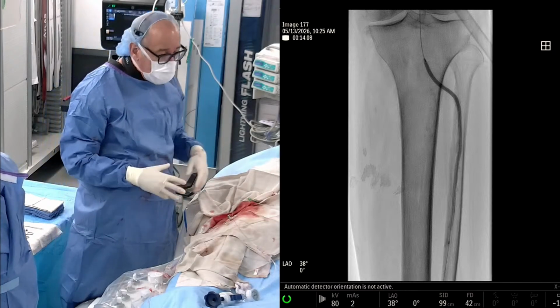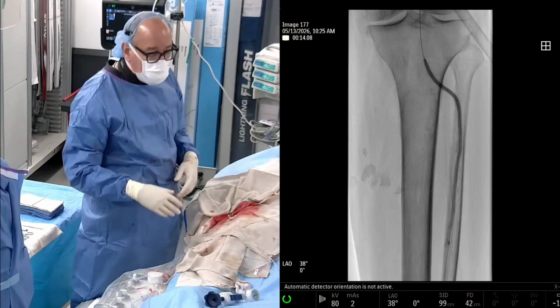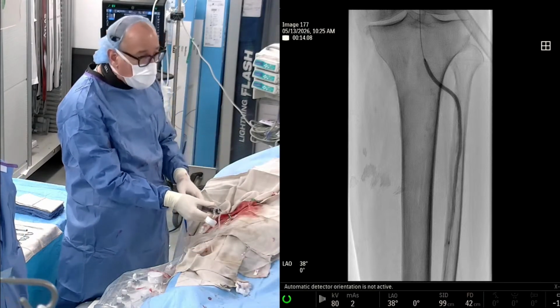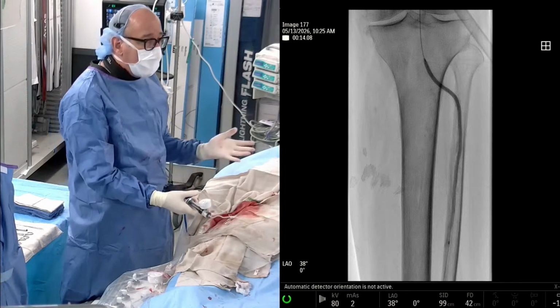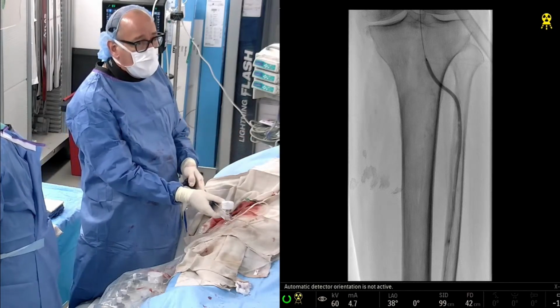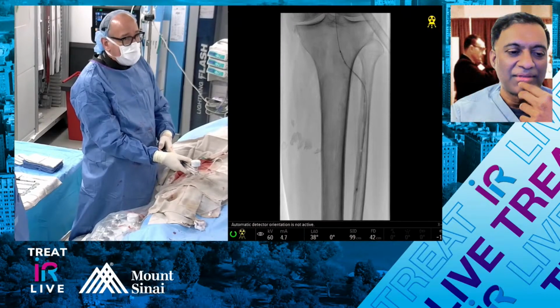So Joji, when I think about IVL, it's clearly becoming something that we're incorporating more and more into our practice. In your practice, are you using it all the time, sometimes, never? Are you a lot enamored with it? How do you think about it?